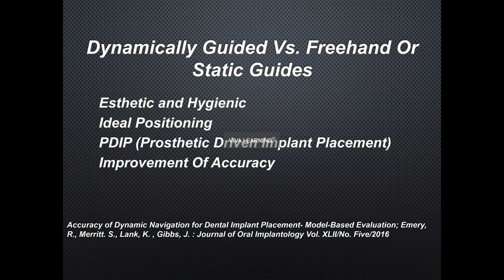So ideal positioning is going to help you. Prosthetically driven implant placement is going to tell you, am I able to use this site right now for an implant, or am I going to need to do some pre-grafting? And then finally, it's going to improve our accuracy. And for me, that really gives me the confidence to know, hey, that's why I'm going to do this every implant, every patient, every time.